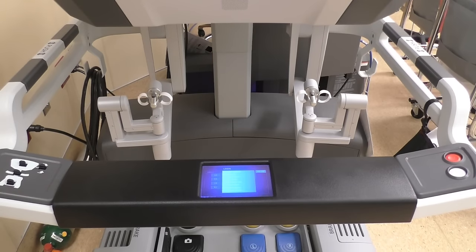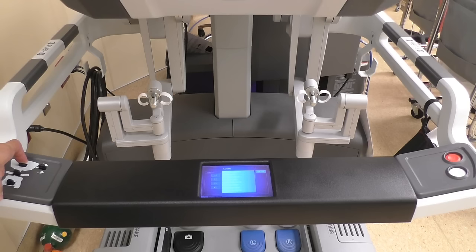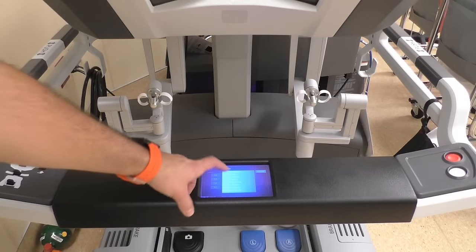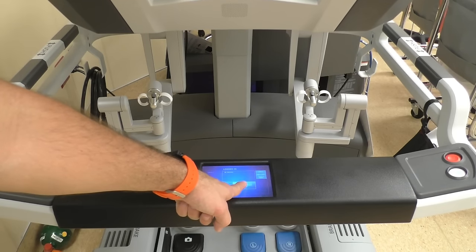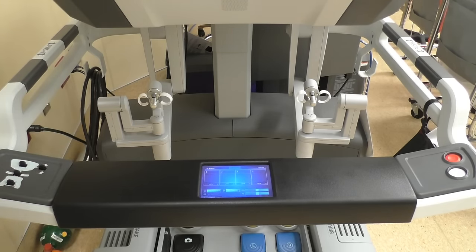Moving down the console, we have these buttons — these are basically movement buttons that can move the plates and move the console itself up and down depending on the surgeon's height and what's comfortable for them. What's nice is we actually have presets available that they can save; press and hold a button and it'll automatically go back to the surgeon's preset and be ready for them.